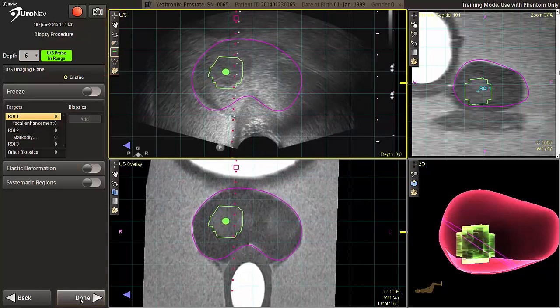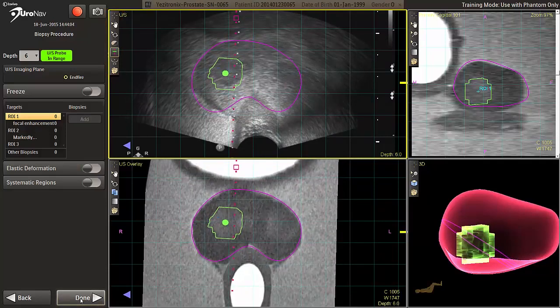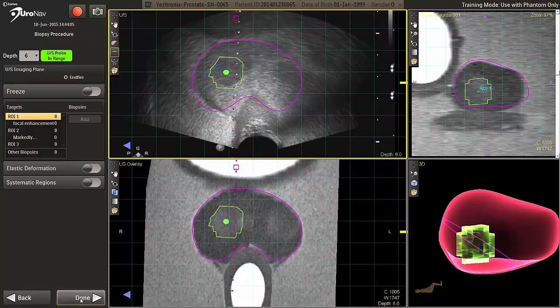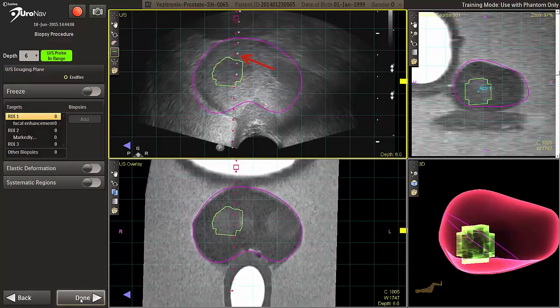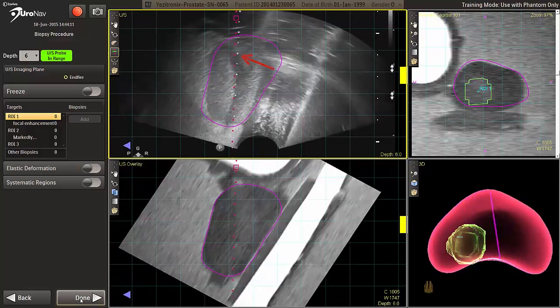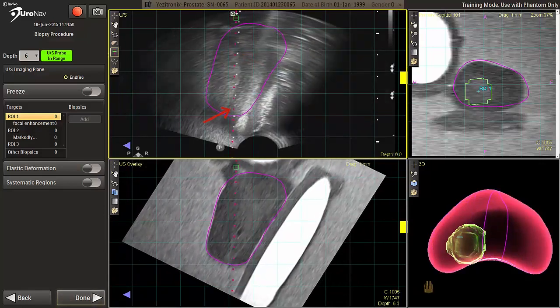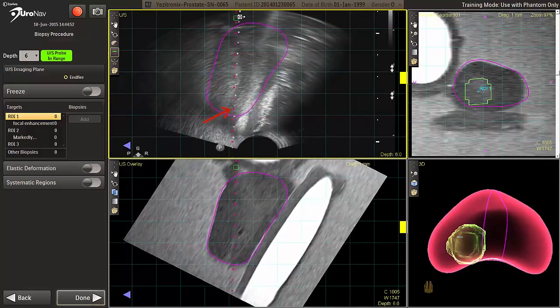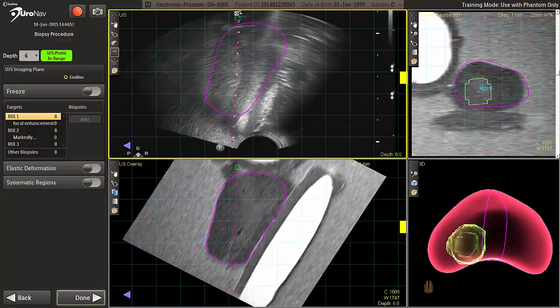Continual fine-tune adjustments will be required to maintain coherence throughout the procedure. If the ultrasound needle guide shown with the white dots is not aligned with the pink Euronav needle guide, corrections can be made by sliding the square pink box at the distal end of the dotted line.